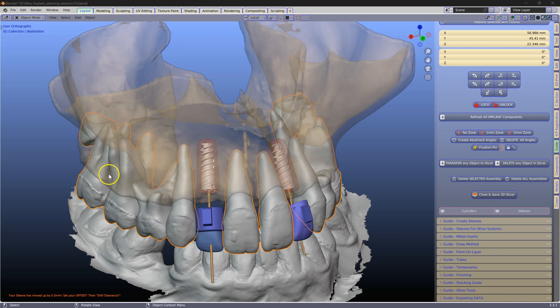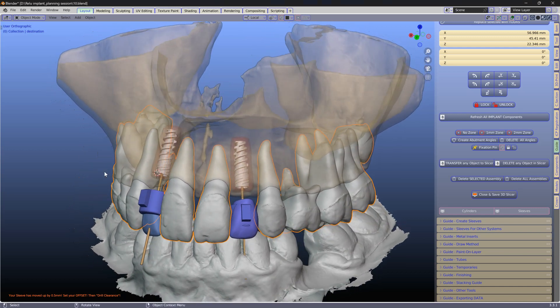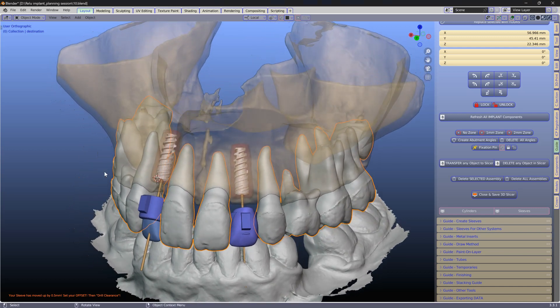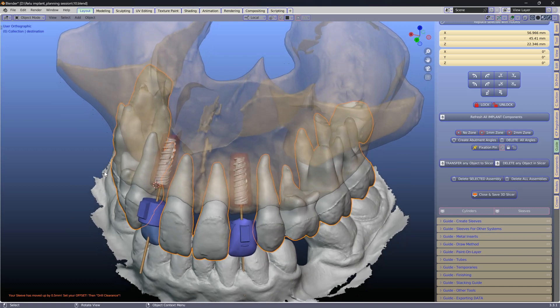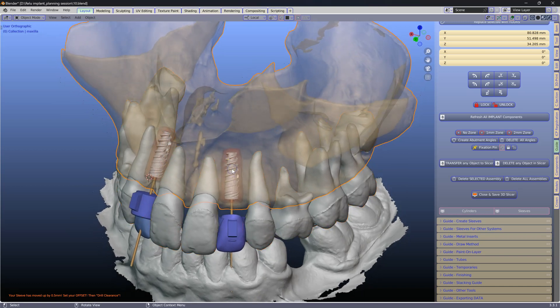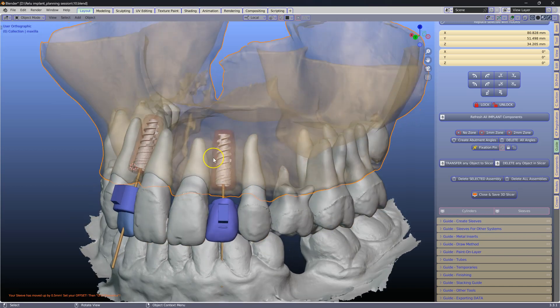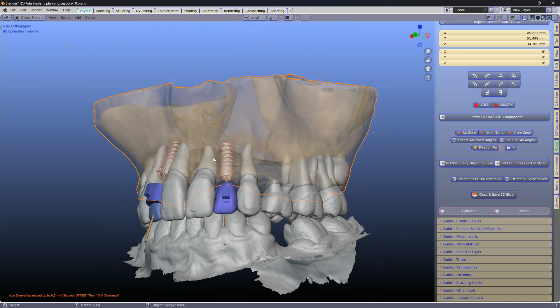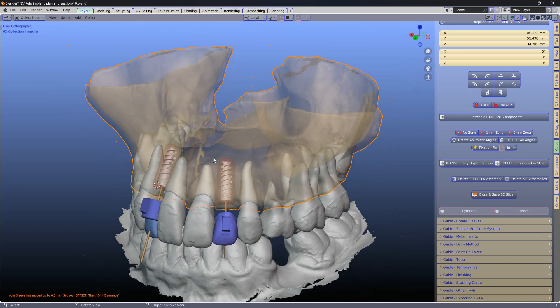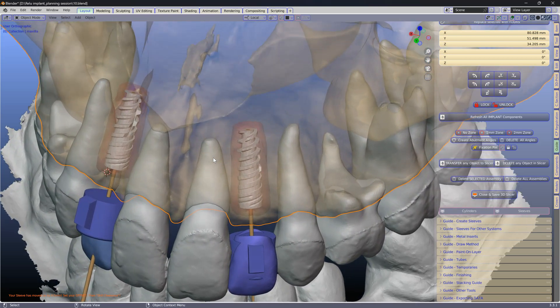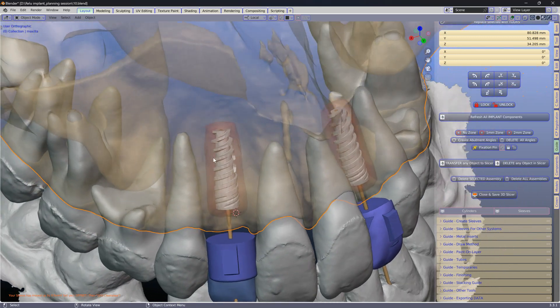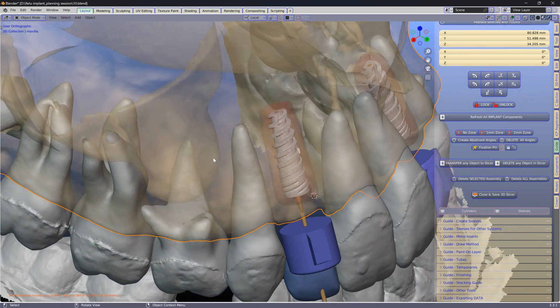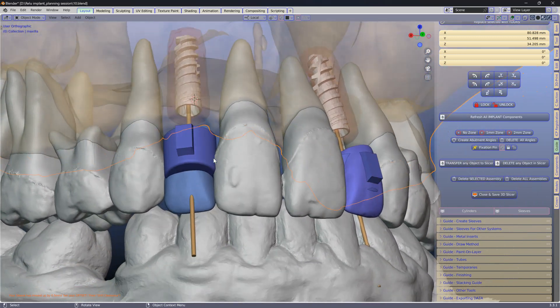Here we have an AI segmentation. With these in Blender for Dental, we are able to now place these implants in the exact correct position. In fact, we have a fantastic visualization of where the adjacent teeth and the root structures are.